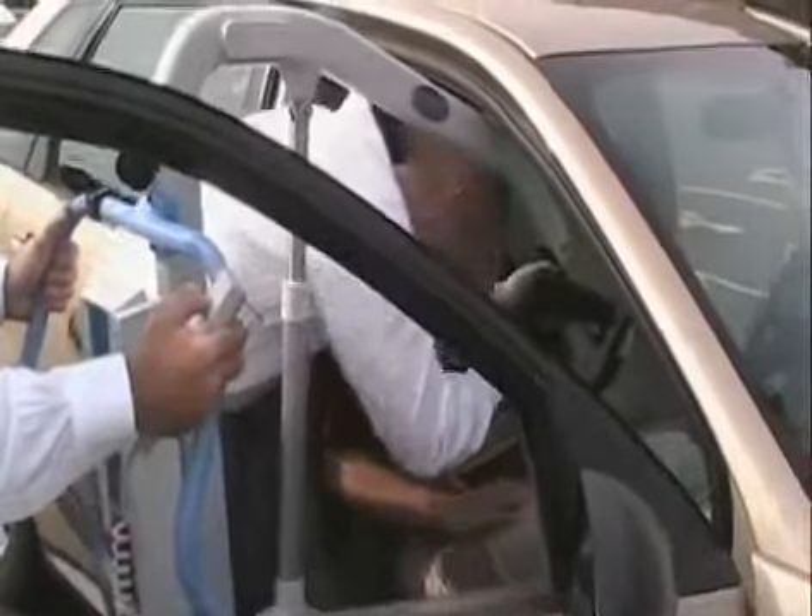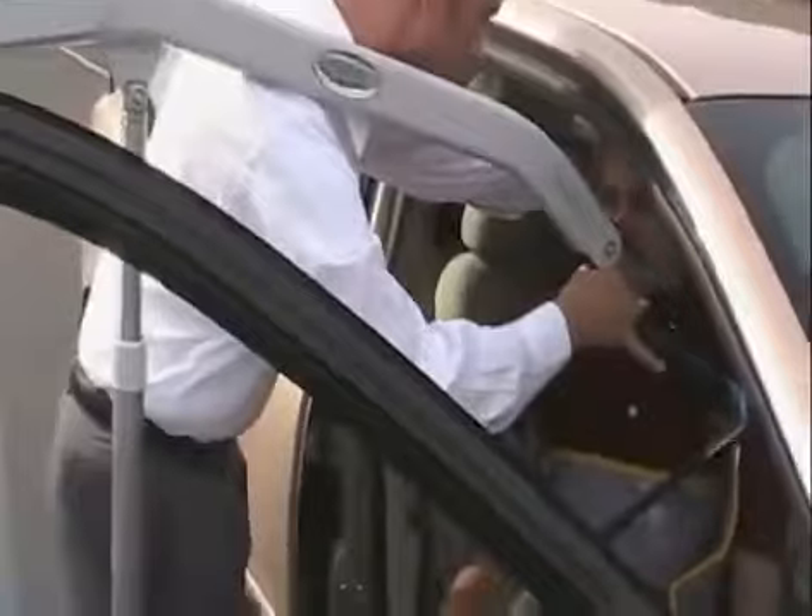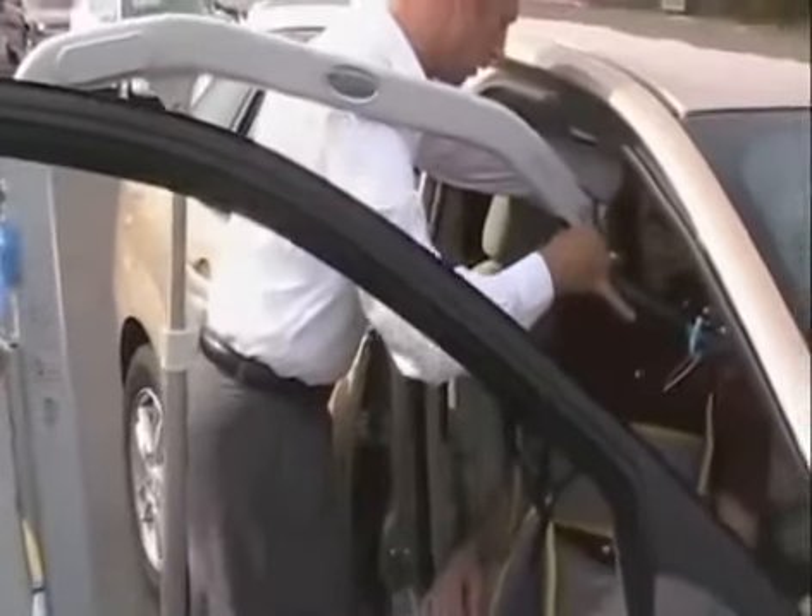So we've made our connections. Now what I'm going to do is have you turn your legs for me, please. Lift this leg up, pivot out, lift that leg up, pivot out for me. If you can turn — that's perfect. Very good, just like that. We're going to go ahead and back up, and we're going to start lifting you out. Go ahead and lean back and move. We're going to lift you out.